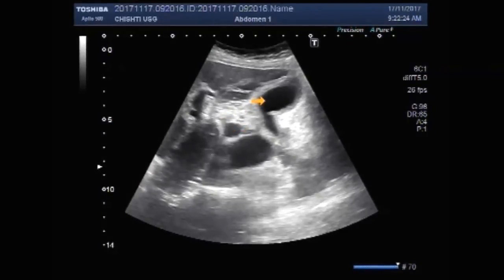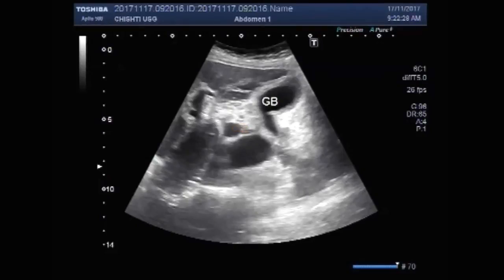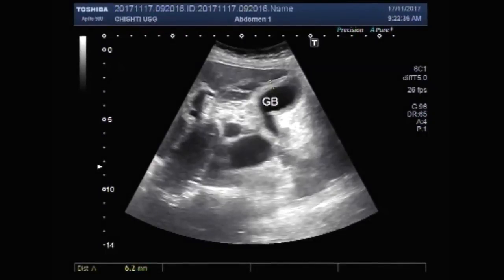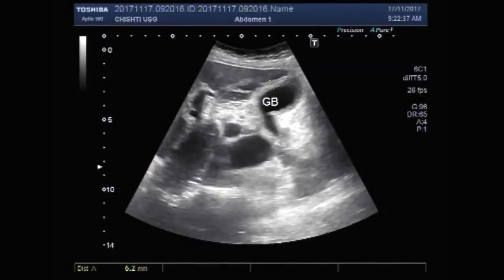This is the gallbladder — a thick-walled gallbladder. You can see the wall thickness is about 6.2 mm.